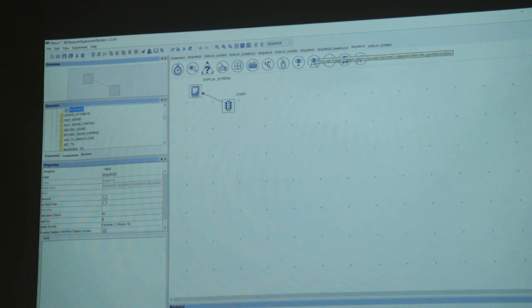So what you can do is, because it's a saccade, you see there are a range of triggers. First one is a fixation trigger, which means it will detect if the eye is fixating at a certain point. That's not what you want. You want the eye to move and land at a certain point, which is a saccade trigger. So you will choose this one for this particular design, which is a saccade trigger.